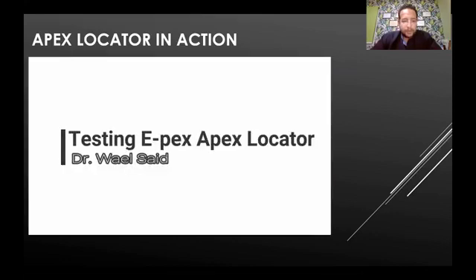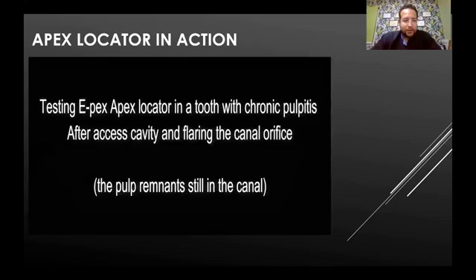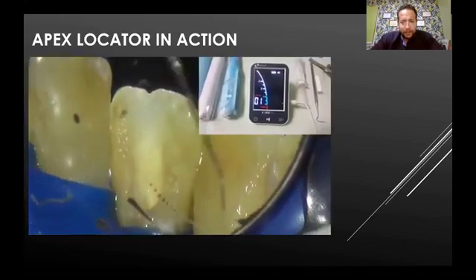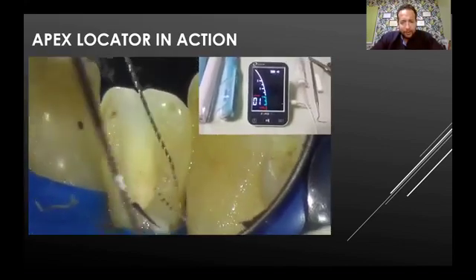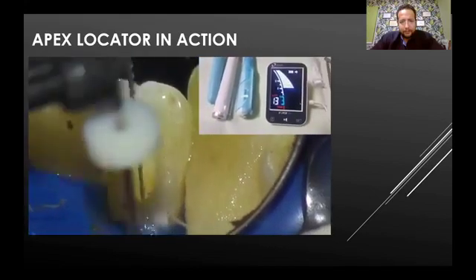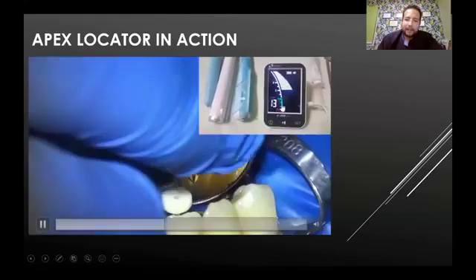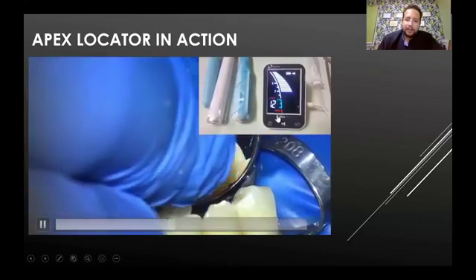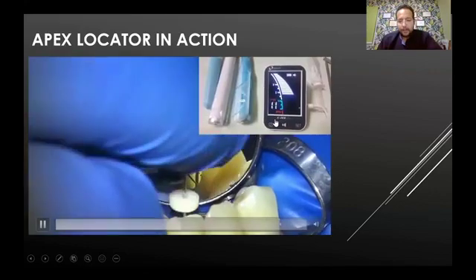That's what was one of my first cases with the Apex long time ago. I think 2 years or more ago. Look how I used the file. Value and the bar increased. Let me hear the beeps.